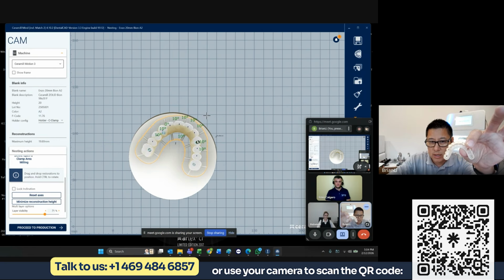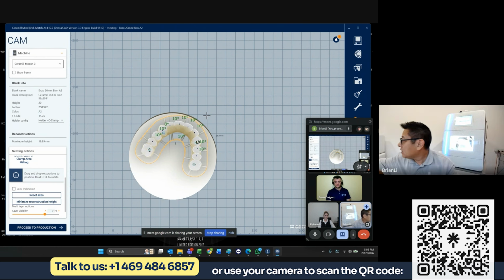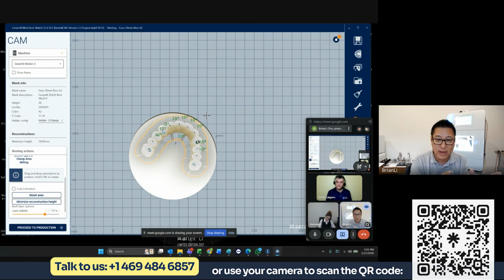Okay, and now in our system, you can create and mill your full arches just with the full arch, or you can do them with a stabilizer. You can do it either way in our system. This is kind of a weird thing, but I've talked to a lot of people about which way is best, with stabilizer and without, and it's 50-50. Some people say, I've done hundreds of units without the stabilizer, everything is fine. I've talked to other people who say you absolutely have to do stabilizers. I'm not here to tell you which way is better. I'm here to tell you, you can do it however you want. If you want to use a stabilizer, you can. If you don't, you don't have to.